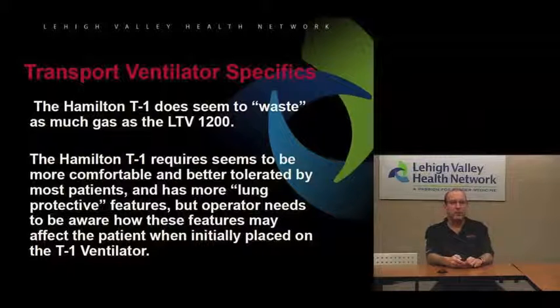Hooked up a rather large endotracheal tube, cut it off, and actually just orally ventilated myself just to see what the difference was between the machines. And I could see that on the T1, it got the same amount of volume in that felt more comfortable, and also at lower airway pressures. So the T1 does have some more technology than the 1200.